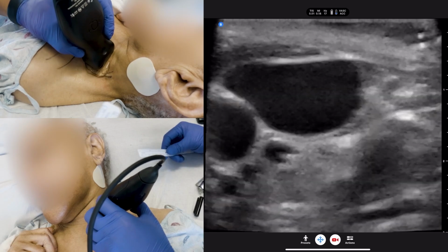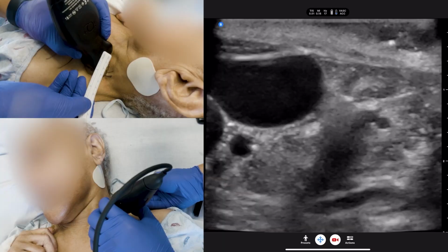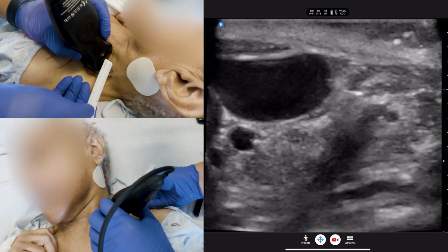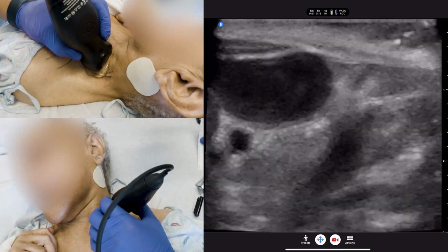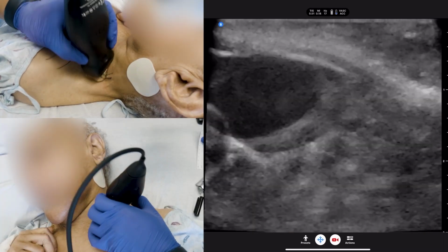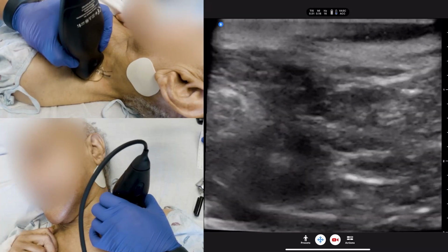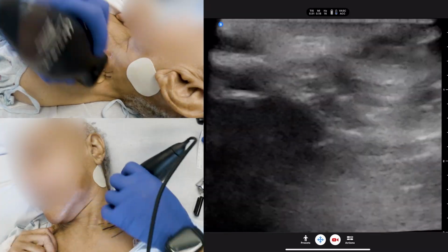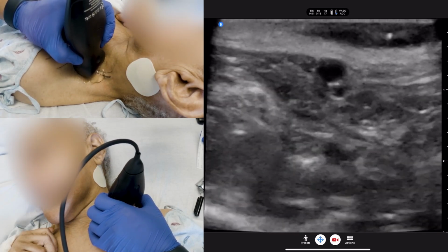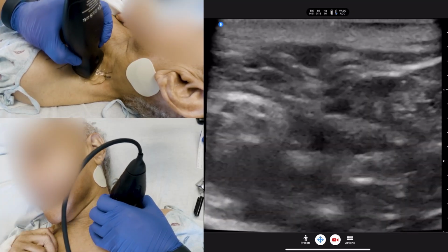So from that center, let's move, yeah, the edge of the IJ, it's about 1 centimeter to the EJ. And what I'm going to do is look for any collateral tissue or objects that I don't want to perforate with the needle when I'm tunneling. So it looks like I can go under. There doesn't seem to be another structure. Oh, maybe that one right there. No, just a shadow.